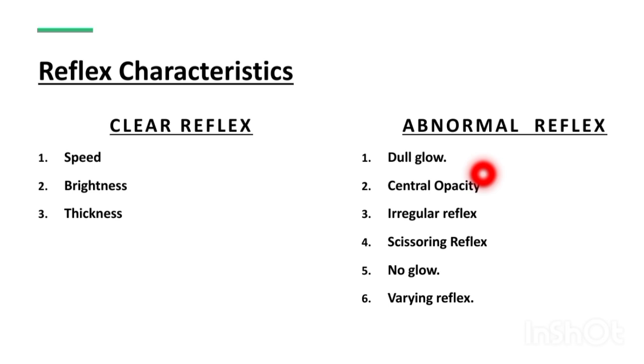So we should not do very accurate refraction in the abnormal reflex. The retinoscope glow will help you decide which patient you should proceed with your refraction procedure, and in which patient you should not waste your time doing a refraction. Okay, in the abnormal reflex there is some pathology present.